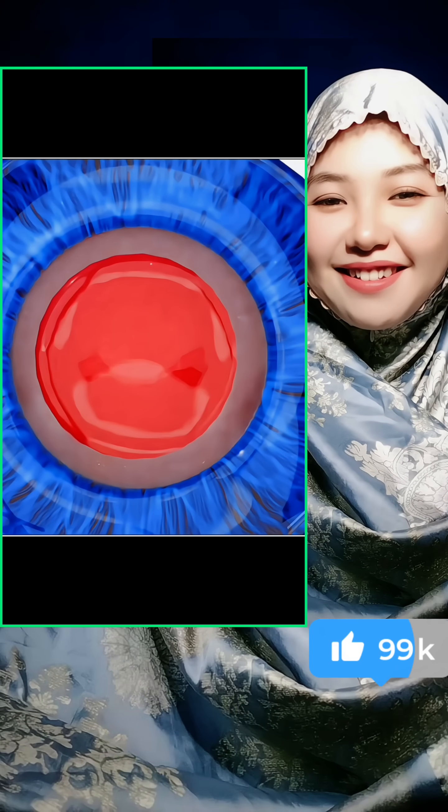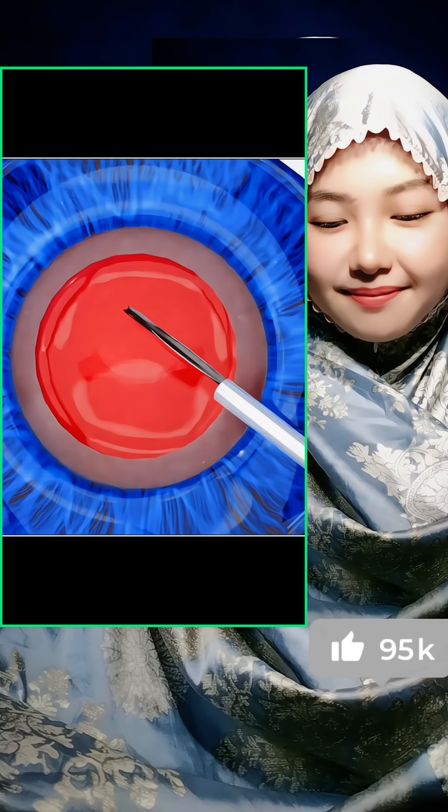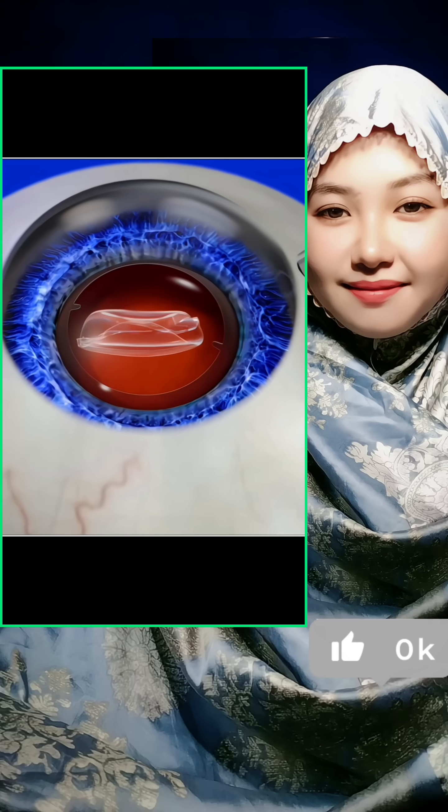Once the old lens is fully removed, a clear artificial lens called an intraocular lens is folded, inserted through the same micro opening, and positioned perfectly in place.